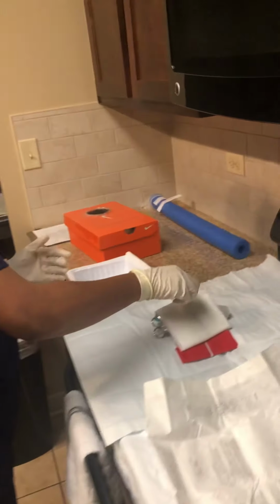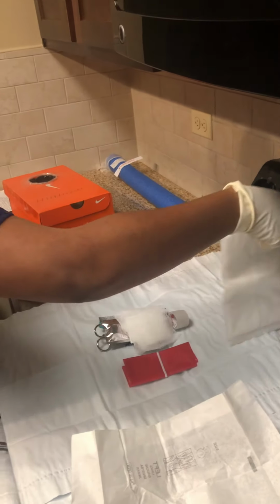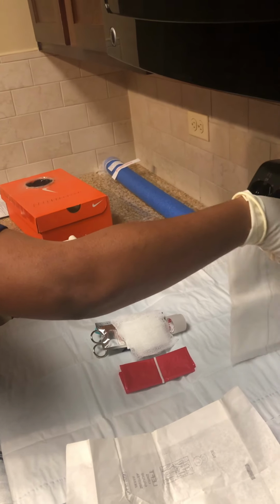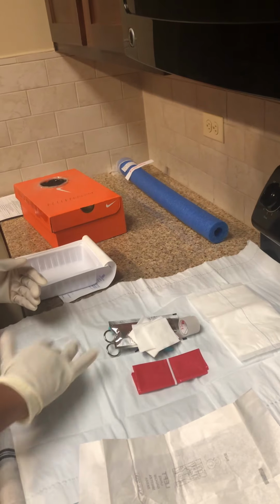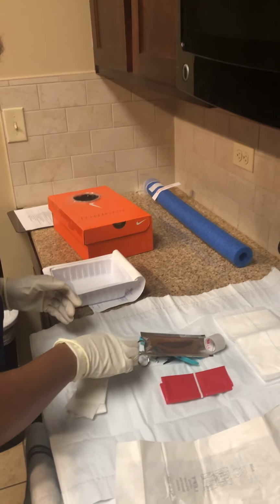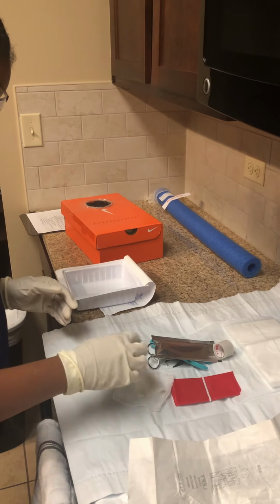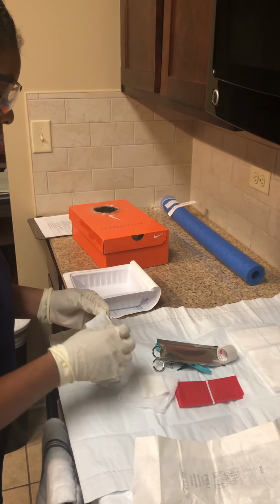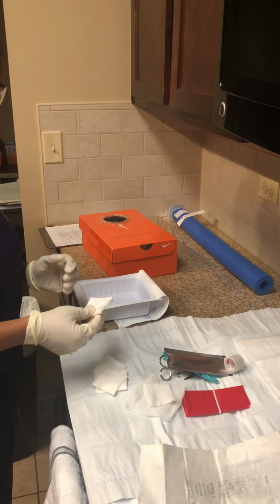I will now organize the contents onto my sterile field. I will then begin to soak my gauzes into the saline.